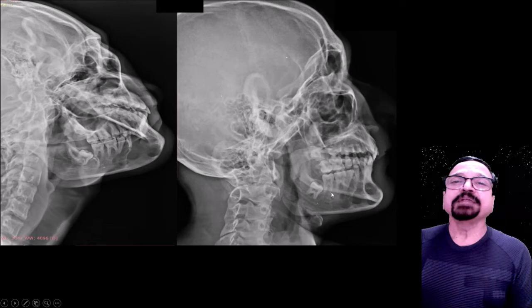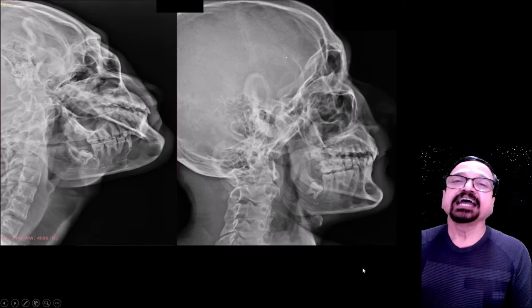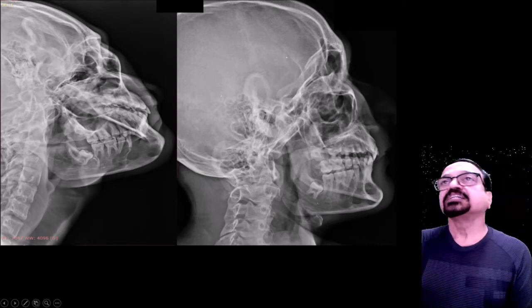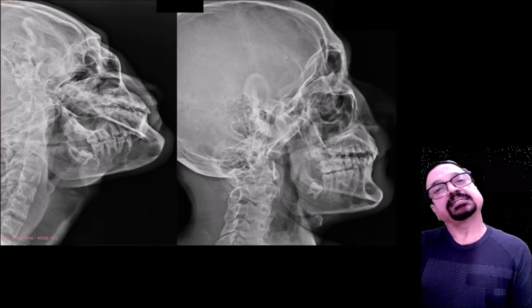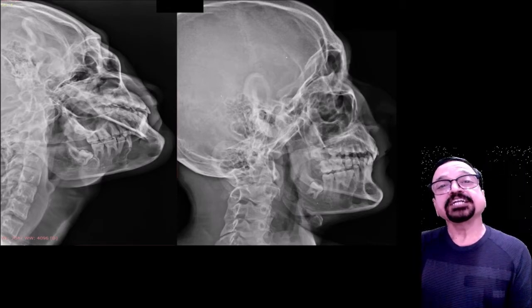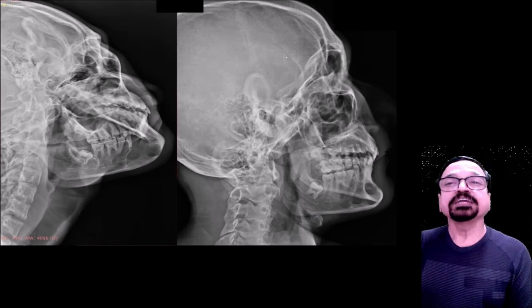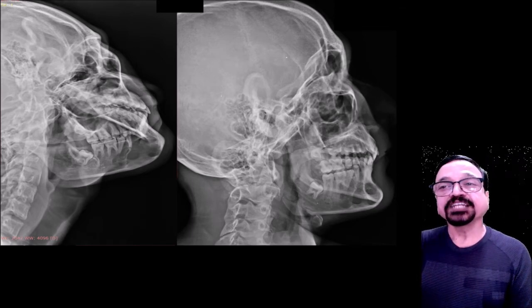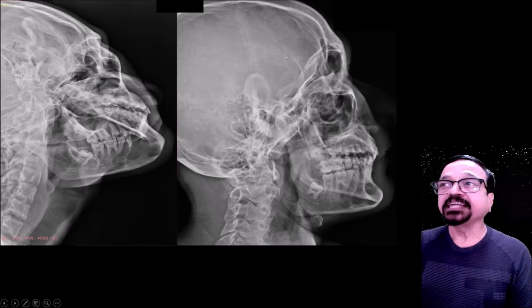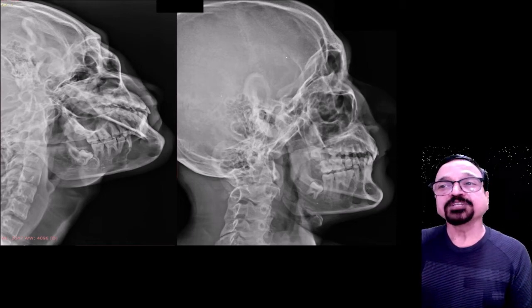So mandible oblique angulations do not have a mathematics. You will have to first check whether the patient can extend his neck. Second thing, we have to see whether the patient can turn to one side. And when the patient turns, what should be the patient's shoulder position? If the shoulder is coming in the way, you cannot give 30 degrees angulation. Then the angulation has to be less than that. So it depends entirely on the type of patients. You can give angulation up to 30 degrees, but sometimes it is not possible.